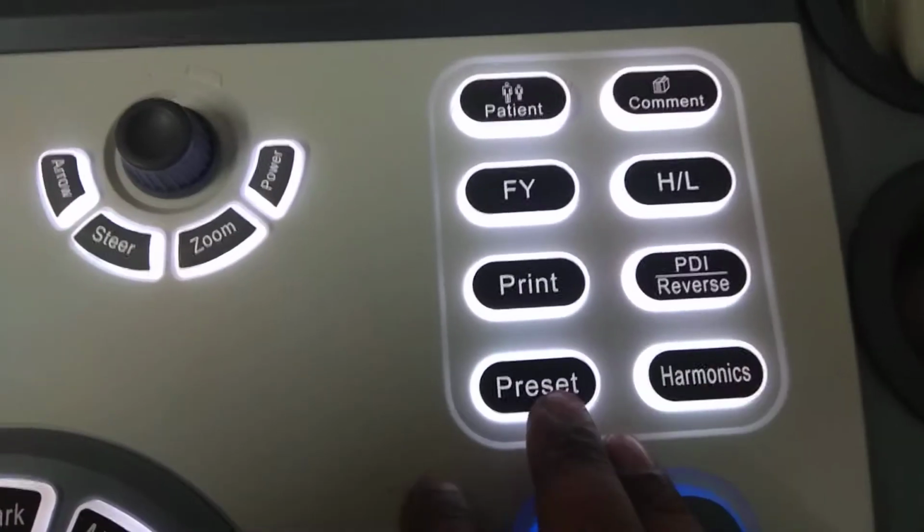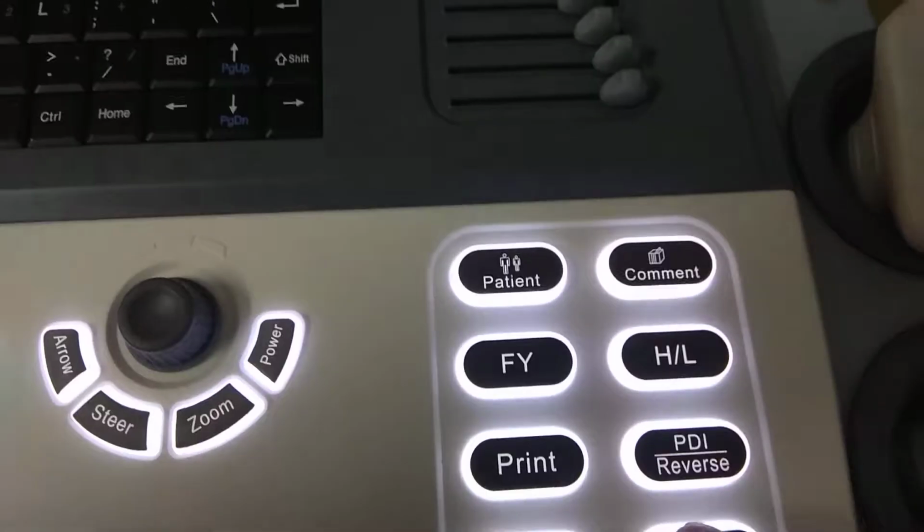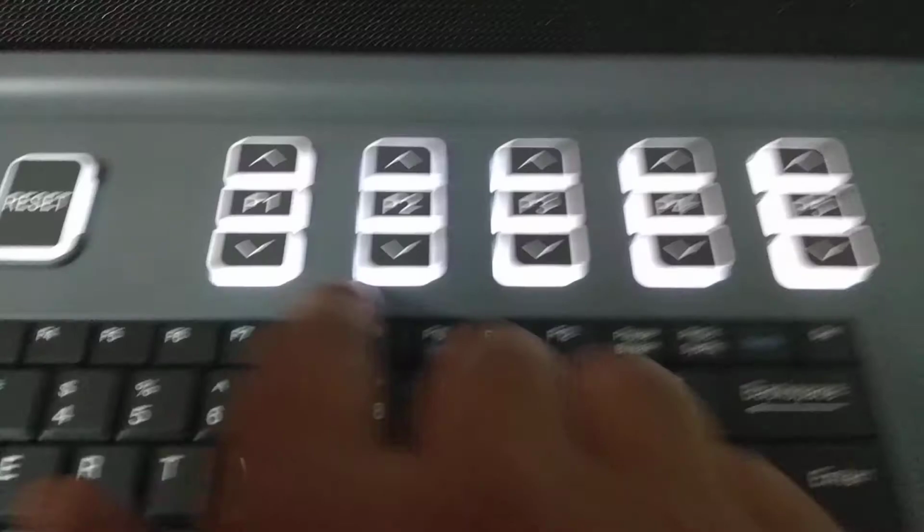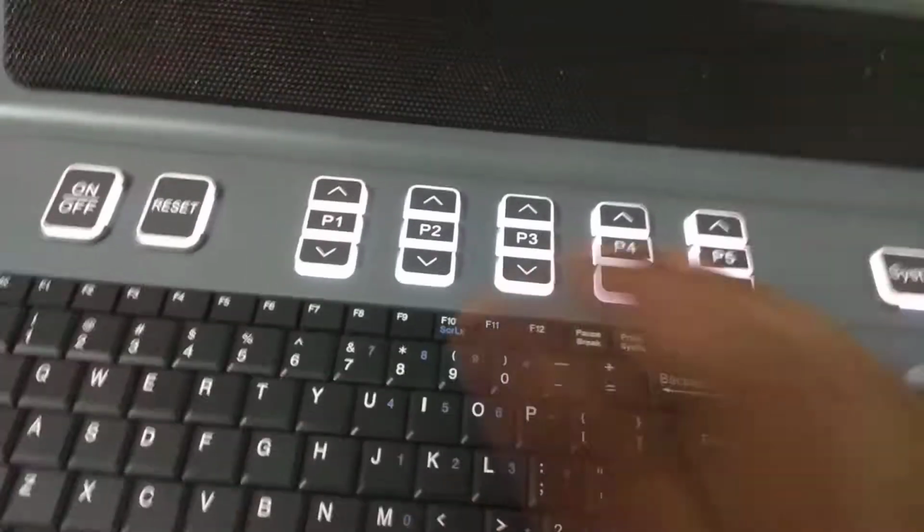This place is dedicated for the patient information section and as well as different imaging modes. This is TGC, keyboard, and on-off switch. We have a reset and on-off, and these are multiple function keys that we will see when we are operating the machine.